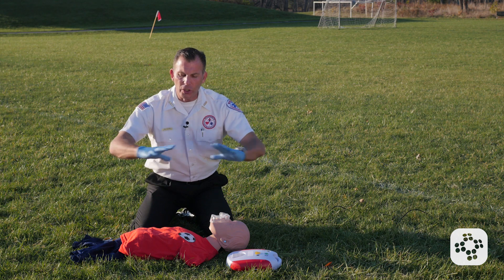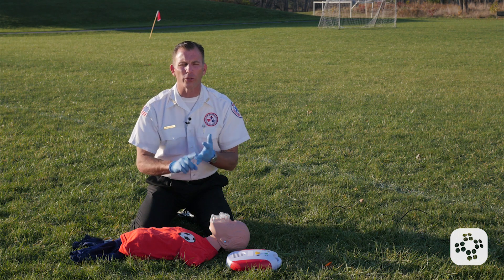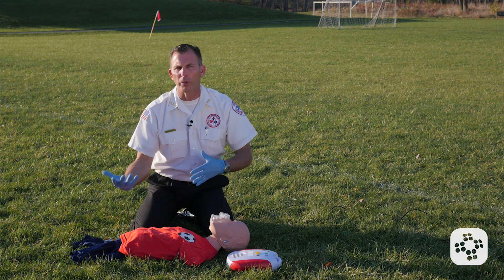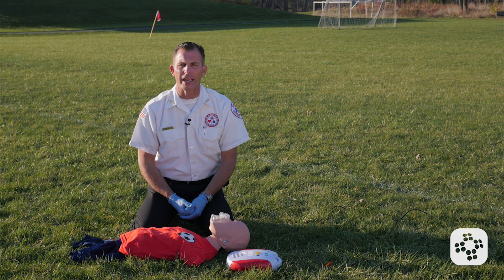We're still going to make sure that the scene is safe to be able to use an automated external defibrillator, which means no combustible gases or fluids, and the child is not laying in standing water. If they were, we would drag them to a place of dryness, dab them off so they're not dripping wet, and then we'll prepare to use the AED.